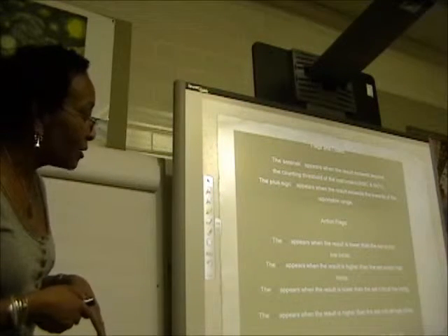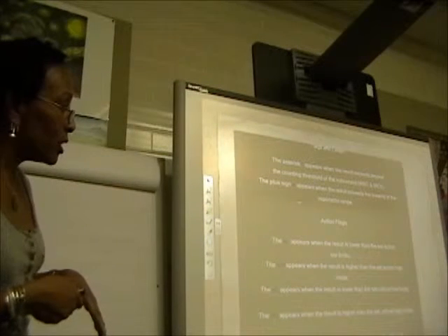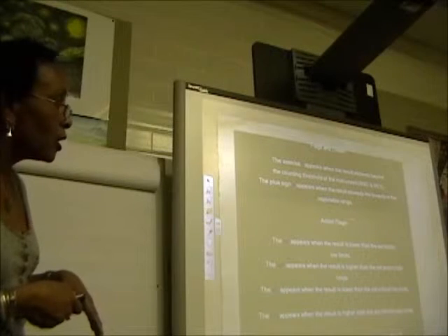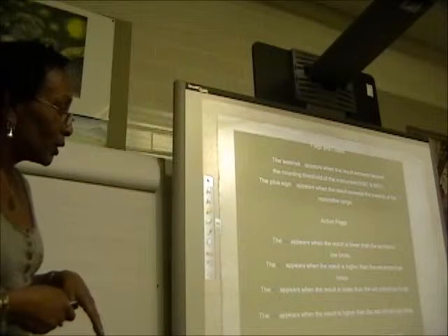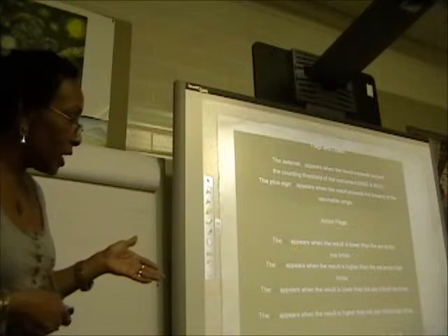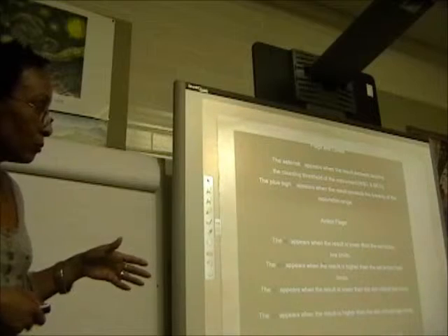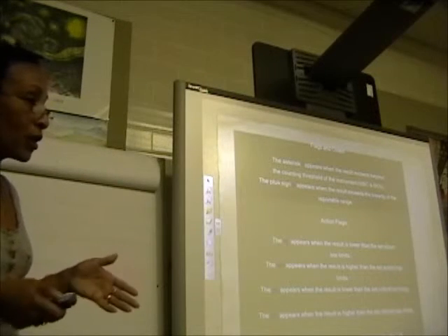The plus sign means the results have gone beyond the reportable range, the linearity of the reportable range. So in these two cases, you're going to have to do a dilution. Okay, and then there are the action flags, the A and the L. The large L is when it's lower than the normal range. So it's a little bit lower, but it's not critical.